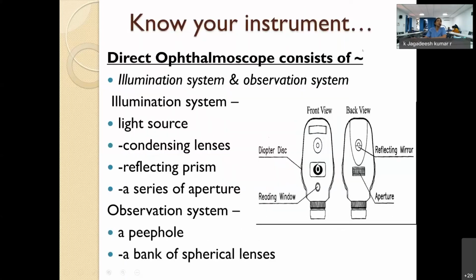So before we know the abnormalities, again, it is important to know the instrument. All the diabetologists and medical specialists may be walking around with a small pocket ophthalmoscope, and this is how it looks like.